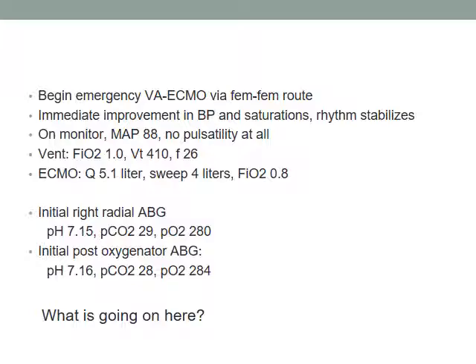So there's no pulsatility. His heart is not pumping anything. It might be beating, but it's not squeezing. For all practical purposes, he's a PEA. Pulseless electrical activity. There's no pulse, there's electrical activity, rhythm stabilized. So is that good? Does it matter that there's no output from there? No, it's bad. That LV can actually clot. The whole LV can thrombose. There's no flow. The aortic arch can clot. Bad. That's on the list of bad things.